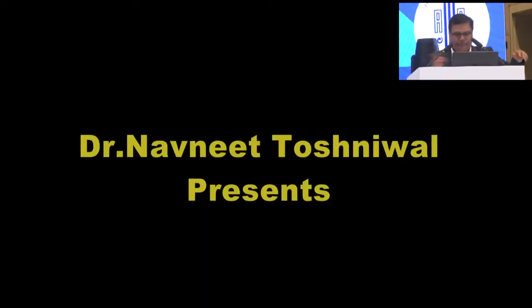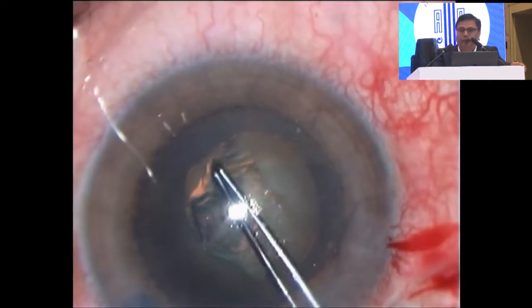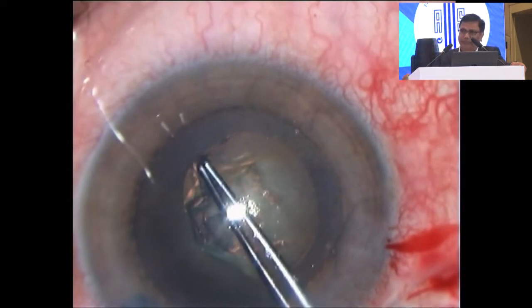The topic we have seen is the hard cataract, mature cataract. Then the other situation which is commonly occurring is the capsulorhexis runaway. We have to proceed with the phaco. We have to see this presentation in 3 parts. Why the capsulorhexis is going to run away, in normal cases also. It may be due to the surgeon, it may be due to the assistant, it may be due to the patient. These 3 situations.